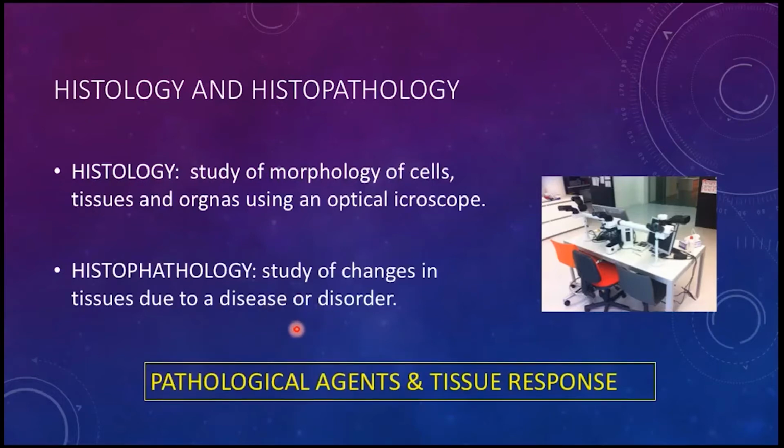So through histopathology, we are able to do two very interesting things. On one hand, we can spot specific pathogens that are affecting a specific tissue, in this case the intestine, but we also are capable to study and to get information about the tissue response to this insult to the tissues.